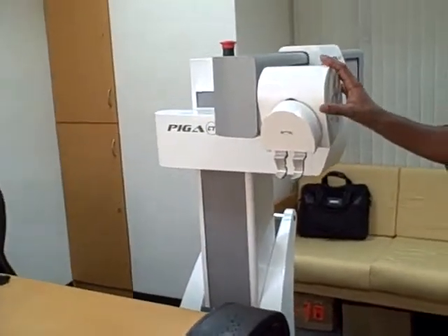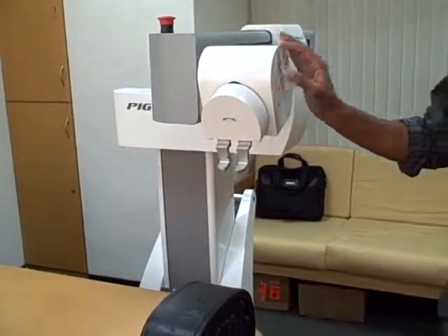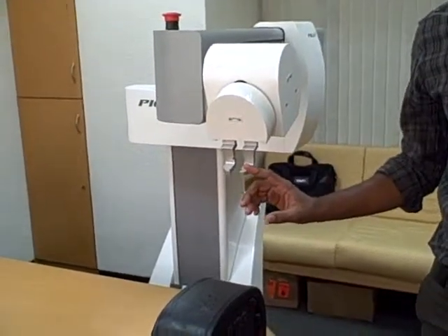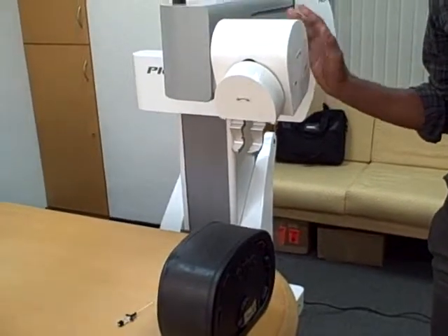So what happens? This angulation is already given by the machine. What the doctor needs to do is just insert the needle through this end effector. All the calculation is done by the machine, the robot. The doctor has to just manually insert.